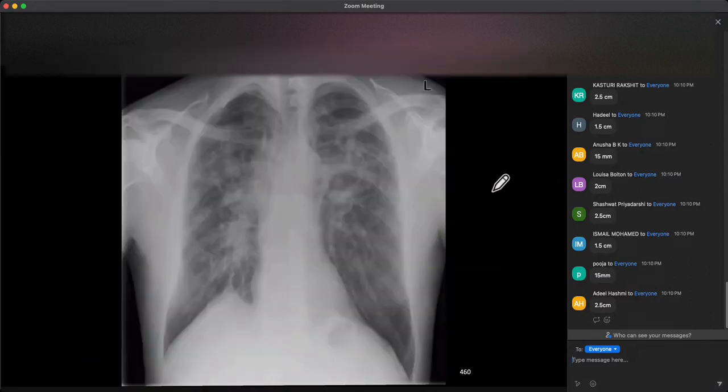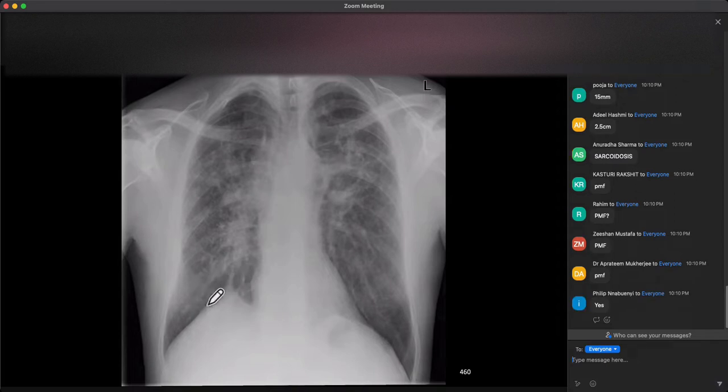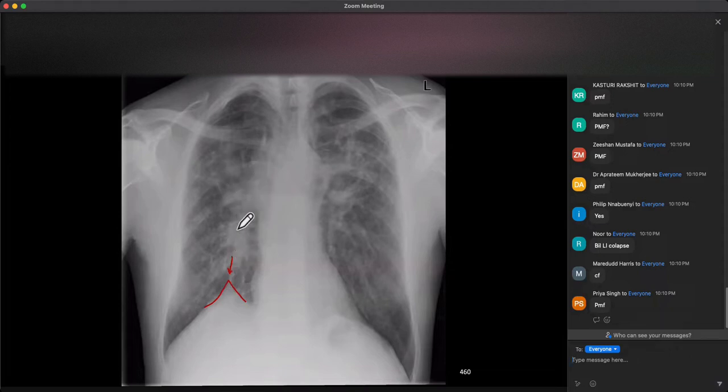Okay, what is going on in this patient? Do you think there's volume loss in both hemithoraces? Yes, somebody's answered yes correctly. So this tenting of the diaphragm is at the insertion of the inferior pulmonary ligament. So something in the chest, in the lungs, is pulling the diaphragm up, and that process is fibrosis. The fibrosis is leading to a mass-like area bilaterally, and we've got very coarse linear fibrotic strands.